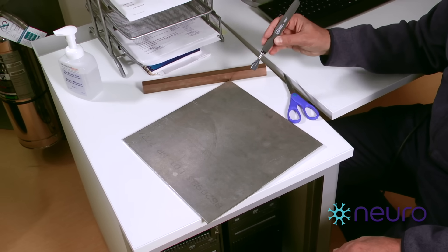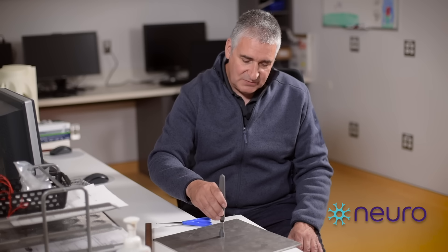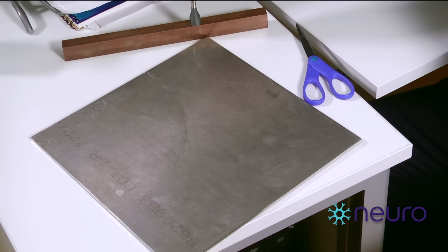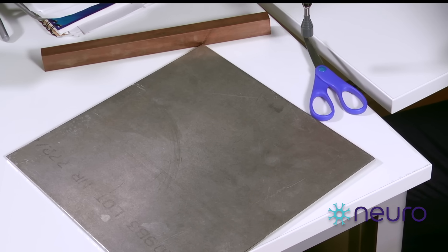Being such a powerful magnet, we have to be very careful about what types of metal go near it. If you look in front of me, I have samples of three different types of metal. This is an aluminum plate, which is not ferromagnetic and is not attracted by the magnet. This is a copper bar, also not ferromagnetic. Then we have a pair of scissors that are made out of steel.